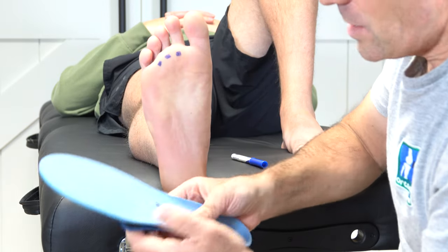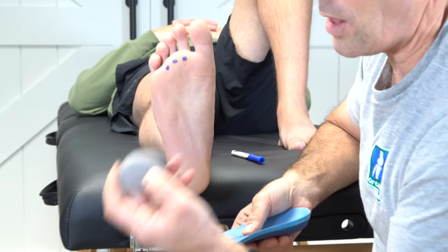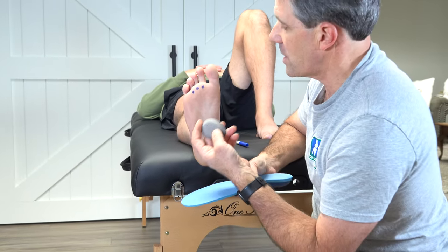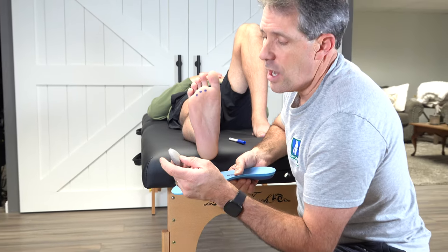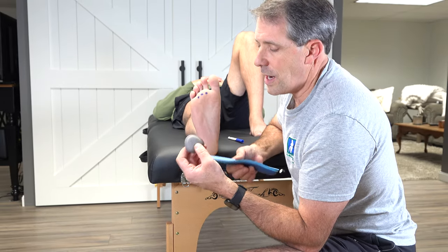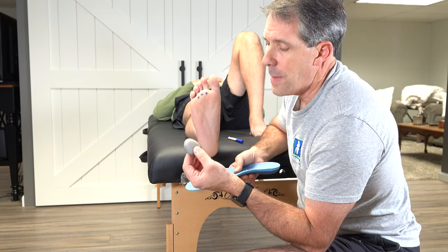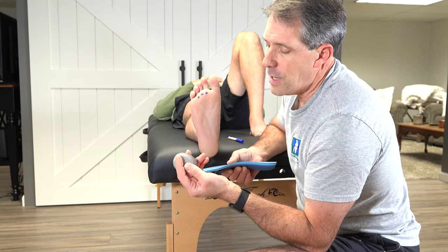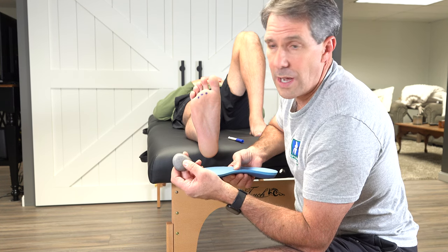These particular insoles come with different size metatarsal pads. This happens to be a large — Michael here is a size 11 shoe. But if you're maybe in a size five or six, you want to get the small ones, and if you're around the eights and nines, you probably want a medium metatarsal pad. I recommend doing this on both sides, because typically if you have it on one, you're likely to get it on the other side.